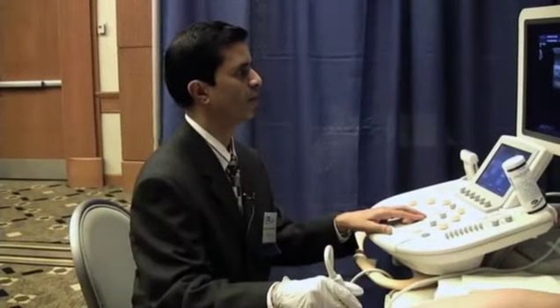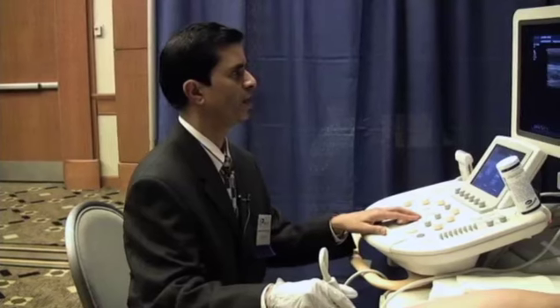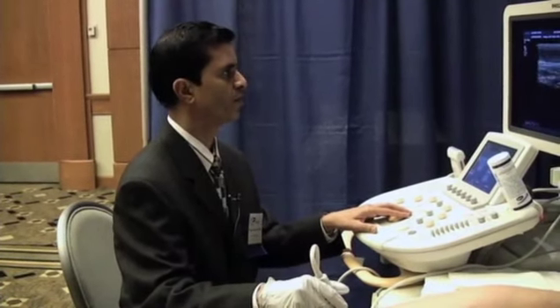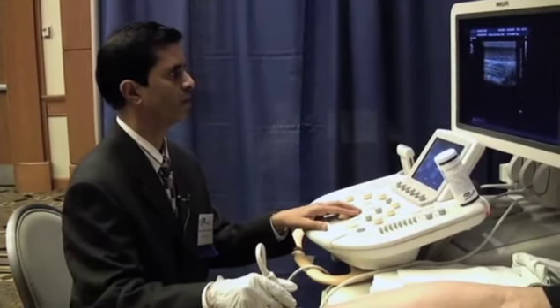This is Nandu Rao. I'm from Thomas Jefferson University. We'll be looking today at musculoskeletal ultrasound, and specifically the ultrasound of the ankle.